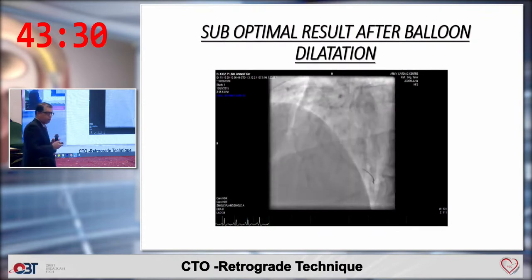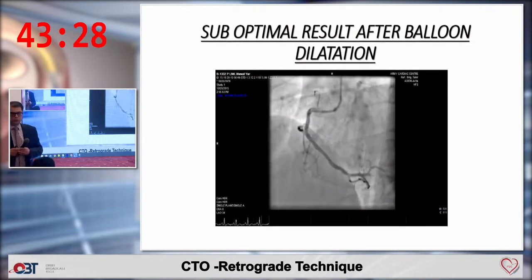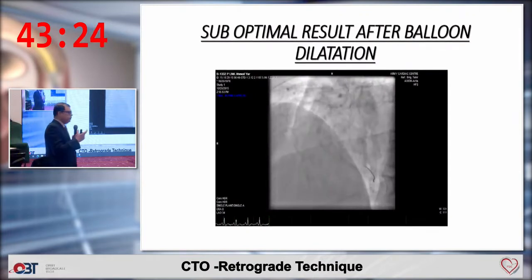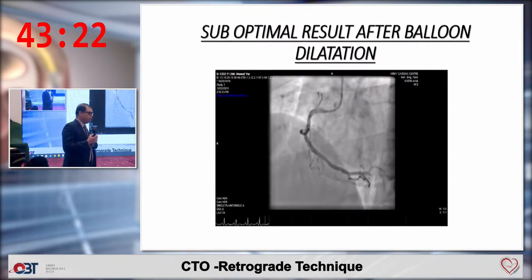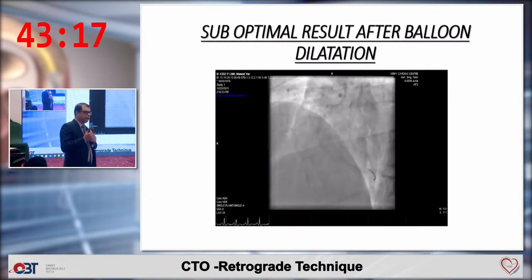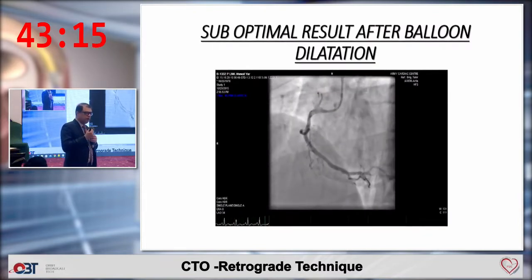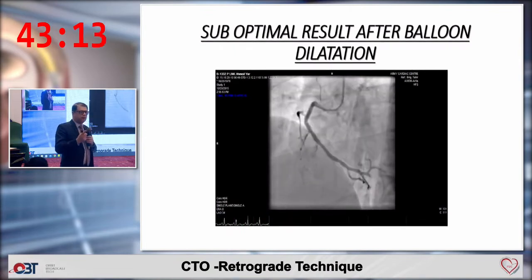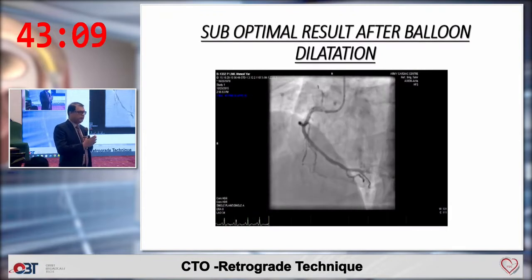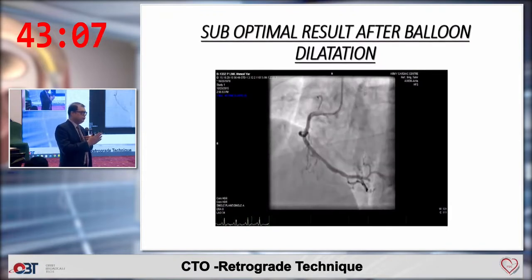What precaution would you take to avoid the cheese cutting effect? For example, pulling up the donor. Yes, so this is an important question. What precautions do you take to prevent the cheese cutting? So you keep your microcatheter inside the epicardial channel throughout the procedure, so it is protected. So the wire doesn't touch the collateral. So that's how you keep it protected.